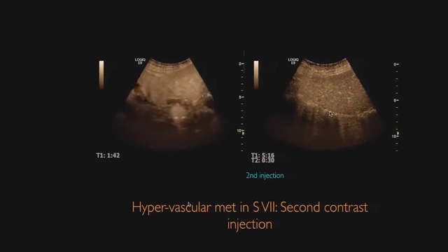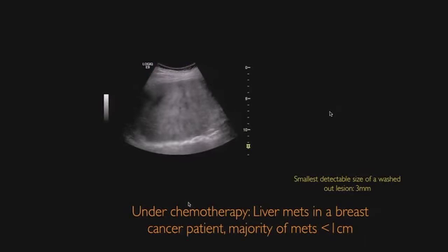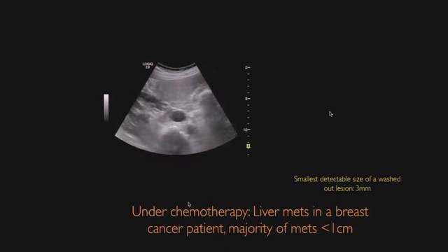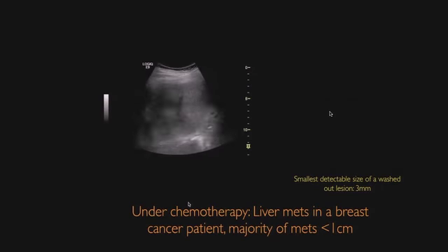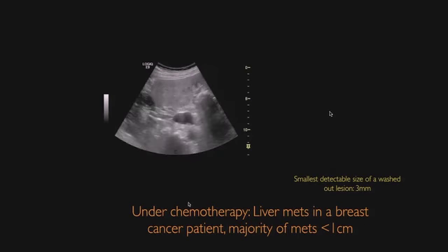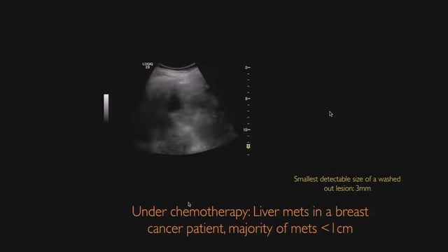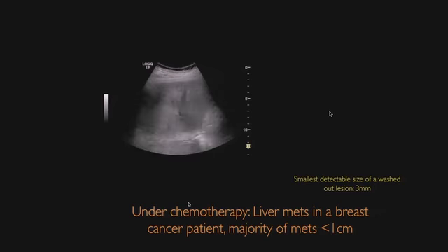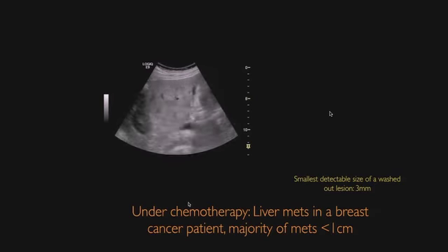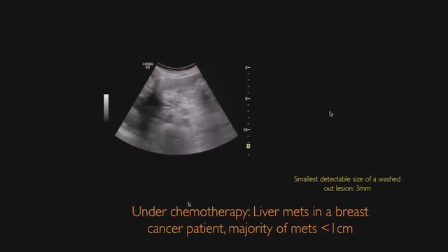This is the one that I was talking about. So this was an eye-opener for me. That was late in 2009 when we said we have to find a better technique to image contrast. So this is a patient under chemotherapy with metastatic breast cancer. We were looking at the liver and we thought, oh yes, maybe there are multiple, maybe there are only a few, but definitely there are fatty changes in this liver due to chemotherapy. So we said, let's look at contrast.